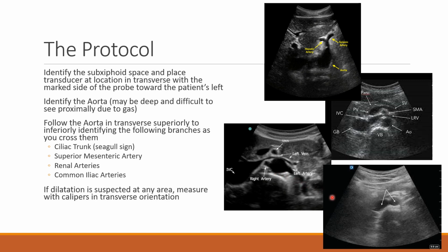And then eventually about the umbilicus region, you're going to see the bifurcation into the iliacs, which should look just like this. So if you're having difficulties getting this region and you're right near the patient's umbilicus, we usually get really poor ultrasound dropout through the umbilicus. So a couple different approaches is to stay above the umbilicus, press with additional pressure, and then without sliding into the umbilicus, simply angle your transducer inferiorly. If that's not effective to show that bifurcation, then you can always take your probe, jump it down below the umbilicus, and then angle upward, trying to get that distal aorta.